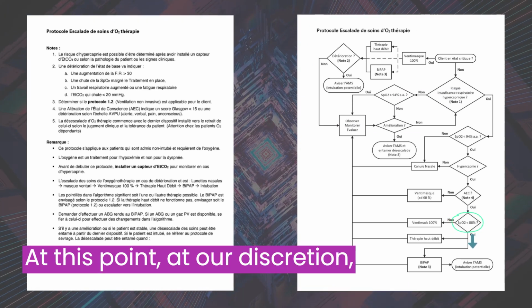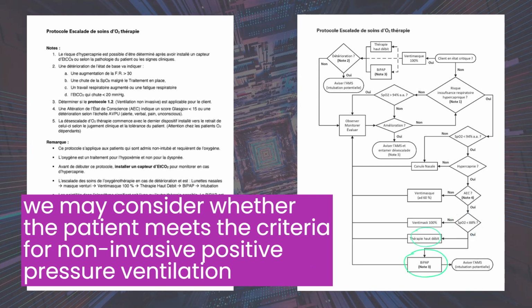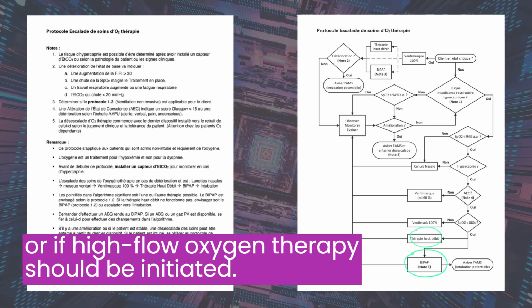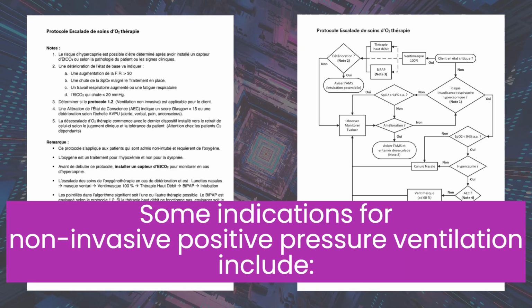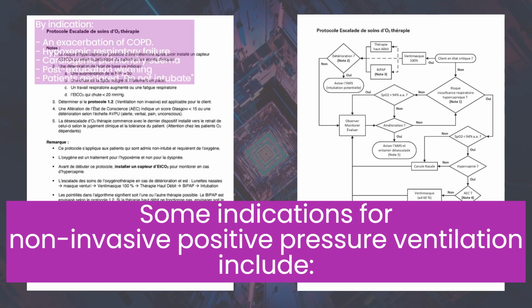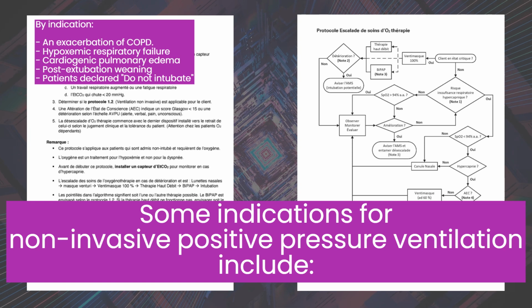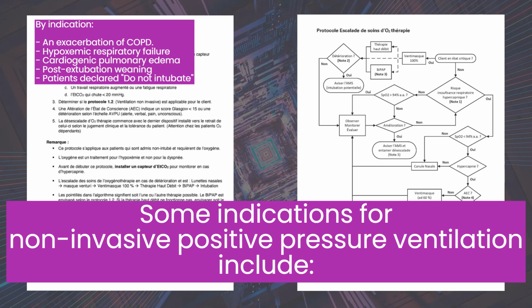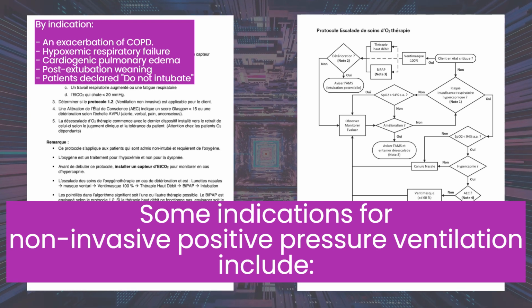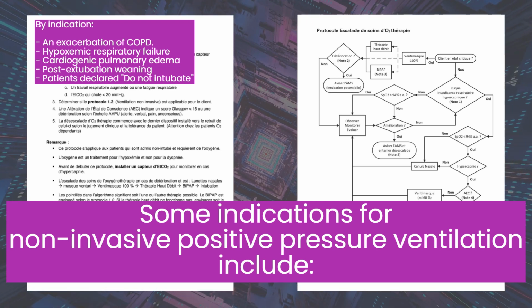At this point, at our discretion, we may consider whether the patient meets the criteria for non-invasive positive pressure ventilation or if high-flow oxygen therapy should be initiated. Some indications for non-invasive positive pressure ventilation include, by indication: an exacerbation of COPD, hypoxemic respiratory failure, cardiogenic pulmonary edema, post-extubation weaning, patients declared do not intubate.